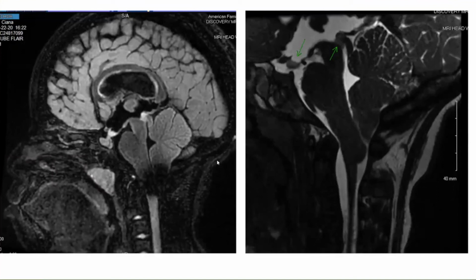Yes, I'm here. These scans just show you, in a higher resolution and zoomed up, the lesions which the radiologist helpfully indicated with a green arrow.